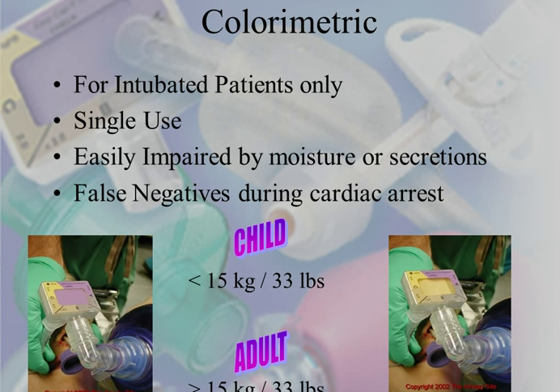So the one on the left-hand side is the purple one. That's actually poor, so P for poor. And on the right-hand side, the yellow, I always say Y for yellow or yes. So that means you're in the right spot. If it's yellow, that means yes, you're in the right spot. If it remains purple, that means it's poor, and you're probably not in the right spot if you're trying to use that for a confirmation device.